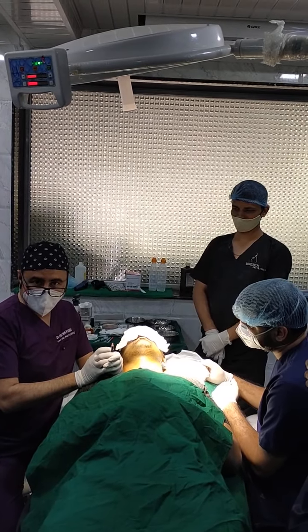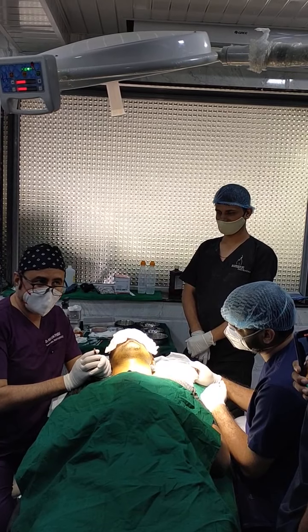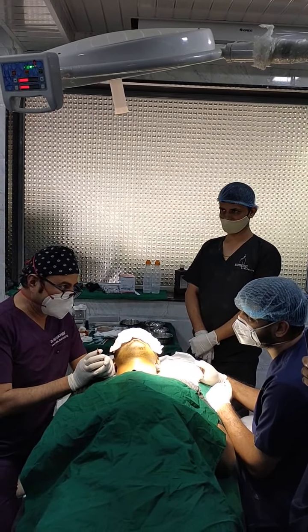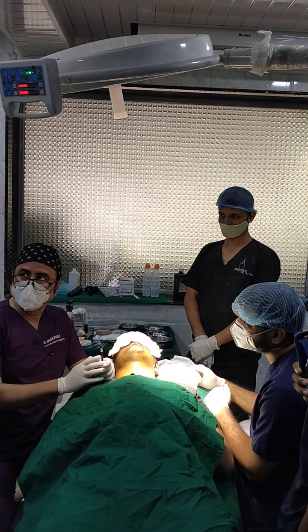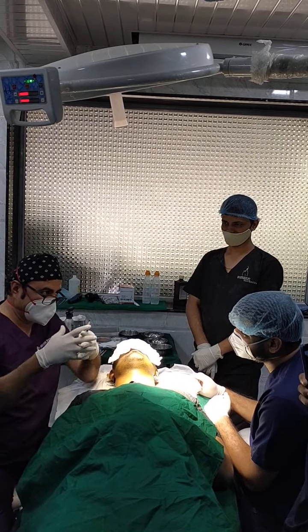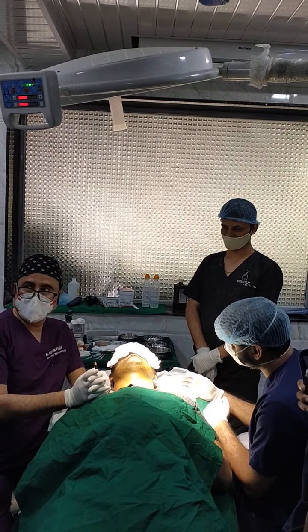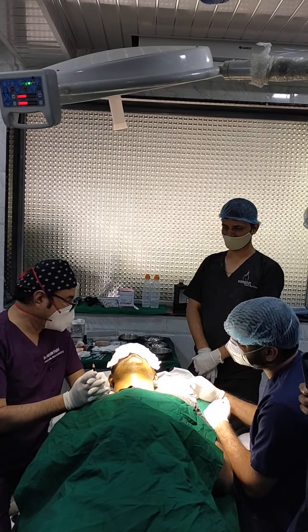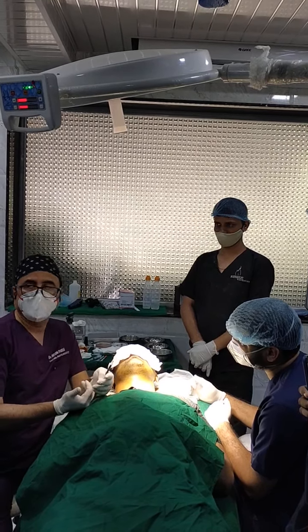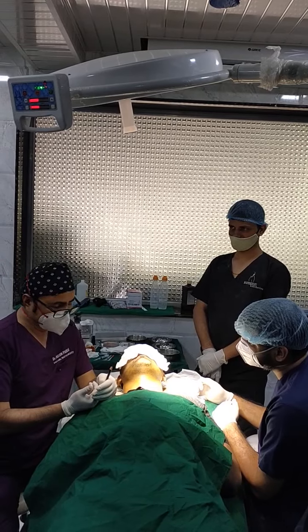And also today morning we have taken about, how many grafts have we taken from the back? 2,500 grafts. Grafts are follicular units, like they are in groups. So we have taken about 2,500 follicular units from the back part. Now we require more. So what is the other donor area? Beard. So today we will be doing the beard.